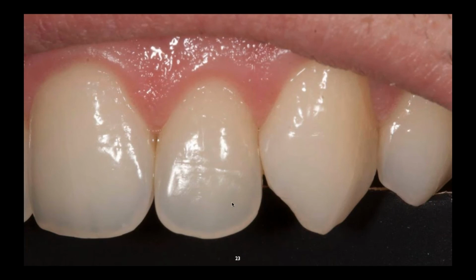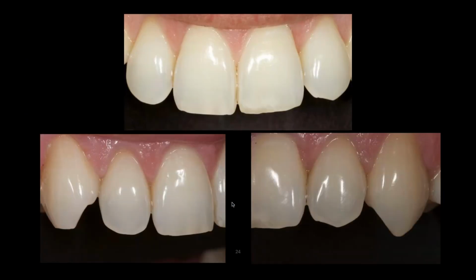So that's the next big question: how do you know what your zirconia is supposed to look like? When you have all these absolutely gorgeous teeth, if you just reduce the light a little bit, you can see a lot more detail. So if a doctor sends you pictures, you have to be careful how bright these things are, because you can change the shade, as you can see from these anterior teeth to these. And so this is the correct color. This looks higher in value.